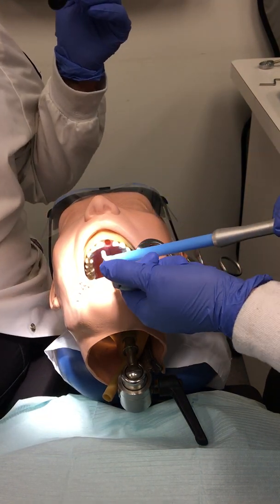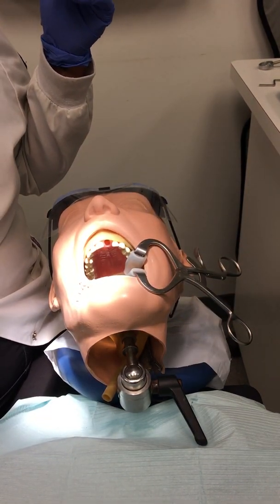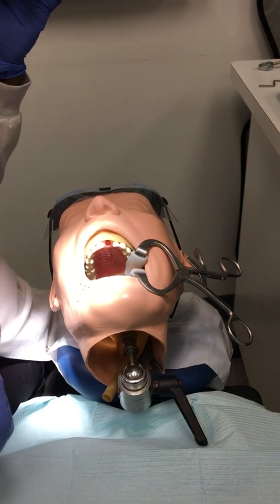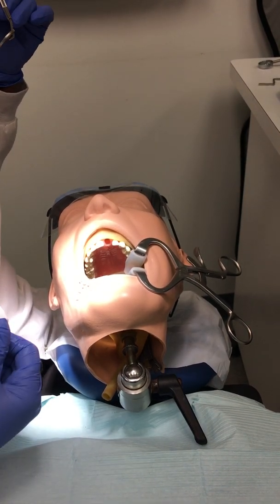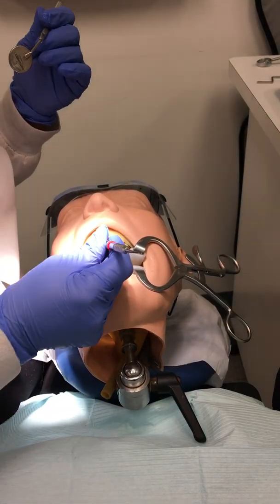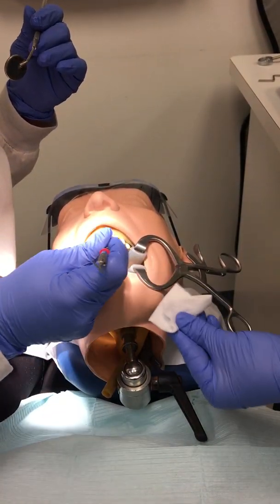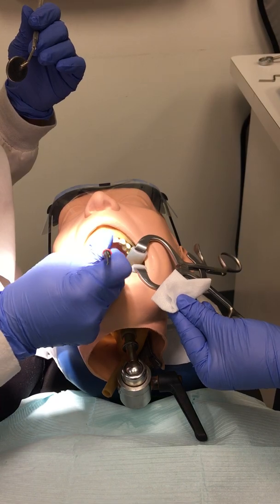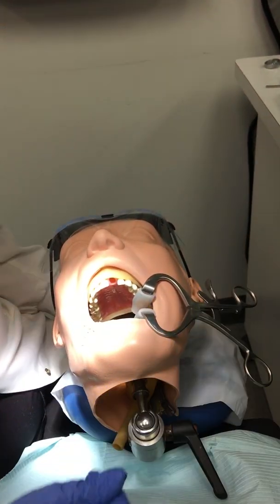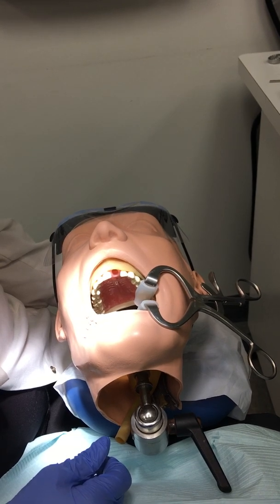The assistant will use the air-water syringe to keep the mirror dry and rinse if necessary. Once the doctor puts down the handpiece, pass the long shank spoon to ensure all necessary decay is removed. Have gauze ready so the doctor can wipe off any excess debris. Rinse and dry the prep.